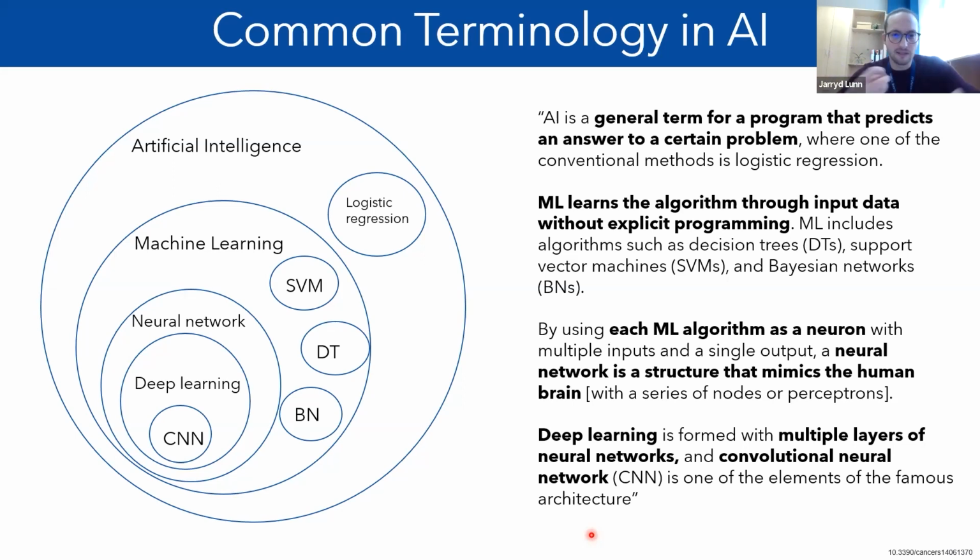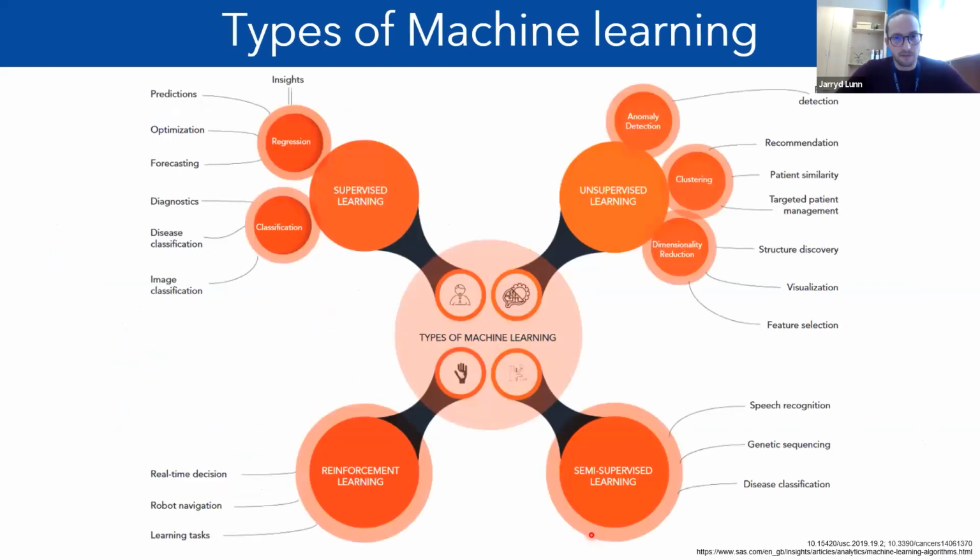And I think knowing these terms helps a person enter this realm of artificial intelligence. So I've just included these. There are different types of machine learning. There are three major types, that is supervised, unsupervised, and reinforcement learning. And what is emerging is a semi-supervised mechanism, which is a sort of crossover of these, being used a lot in healthcare and indeed in cytopathology.